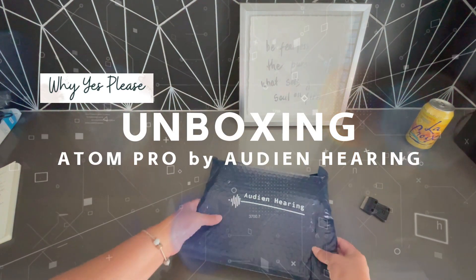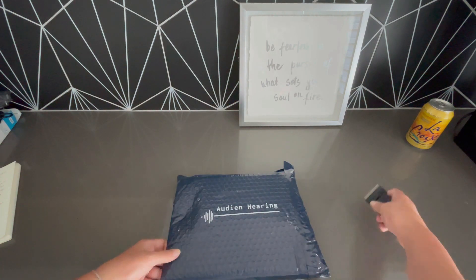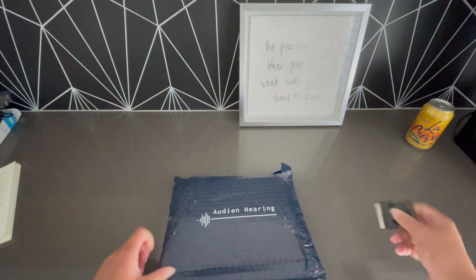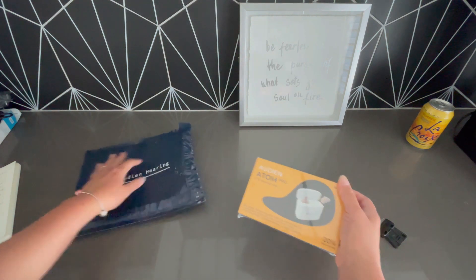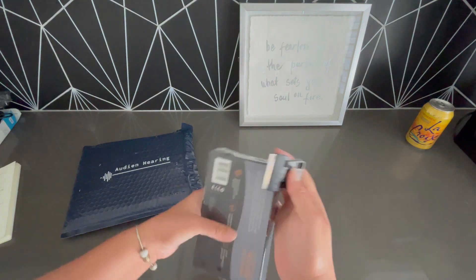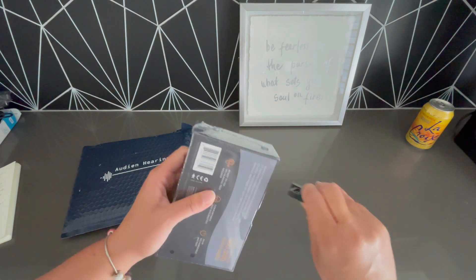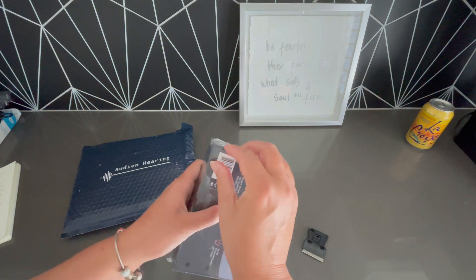Hey friends, this is Sylvia and look what I have here. I have the Audien hearing — I picked up this Audien Atom Pro over-the-counter hearing device. My hearing is not so bad that it requires professional hearing devices, and I wanted to see how this would help. One of the reasons I picked this one up is that it's affordable and it has a ton of ratings.